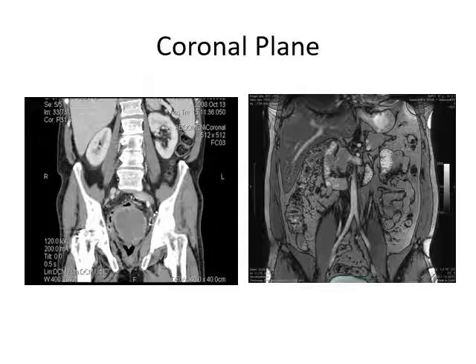Here's our coronal plane, when we're slicing them forwards. This is one that we're a little bit more familiar with. Again, you can see the difference in what features show up. The nice thing about both the CT scans and the MRIs is we can change the view without actually having to change the patient. There's that big psoas muscle right there. You can see it there, and you can see this one here on this patient.